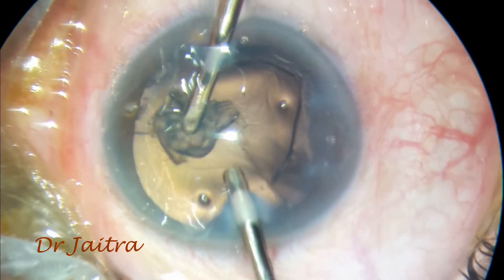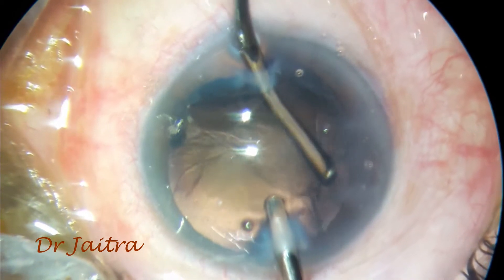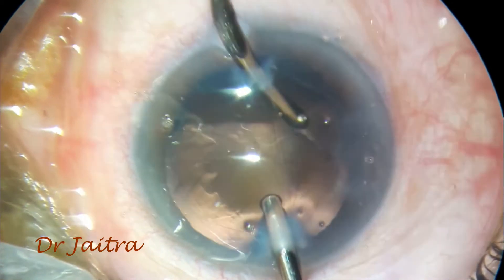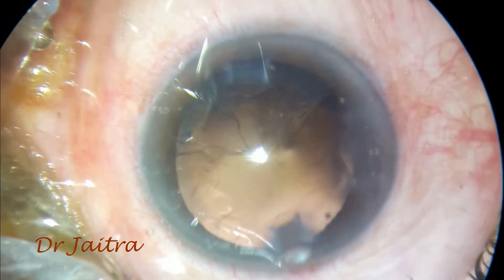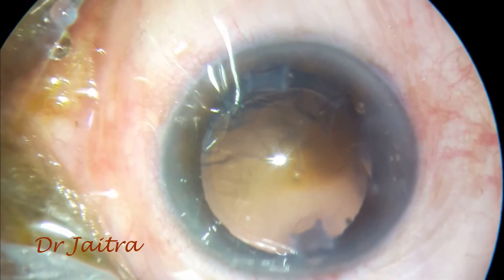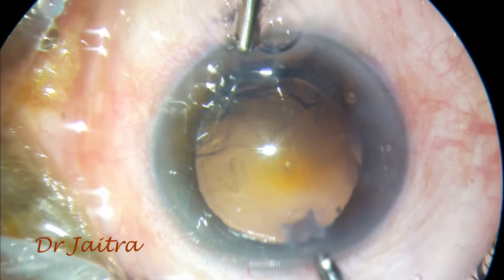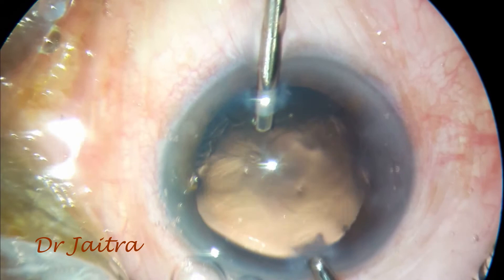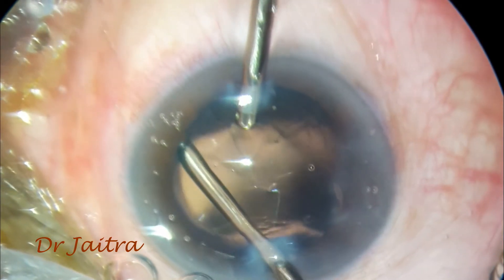I am going ahead with bimanual irrigation and aspiration. After this bimanual irrigation and aspiration, I will go ahead and place the intraocular lens under visco, then aspirate all the visco out and form the anterior chamber. Thank you.